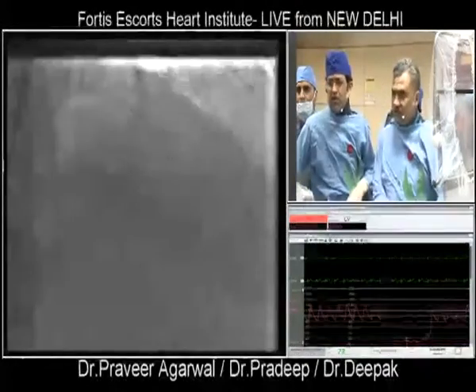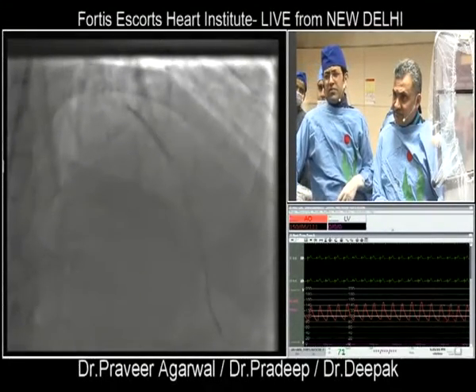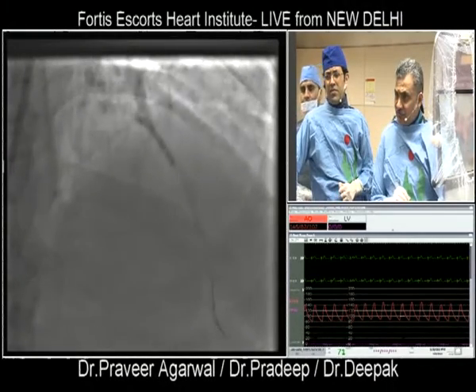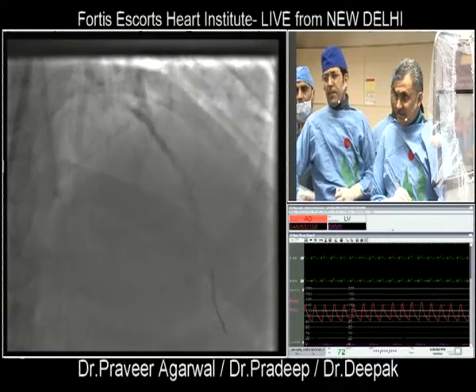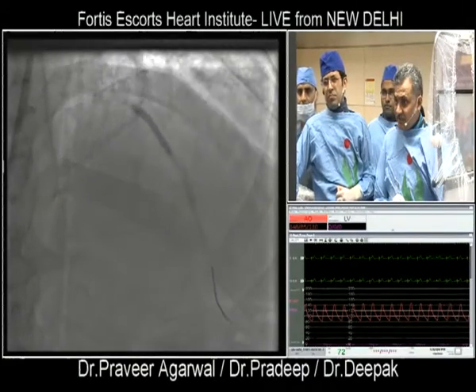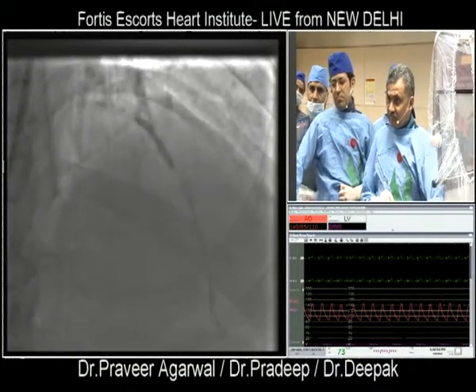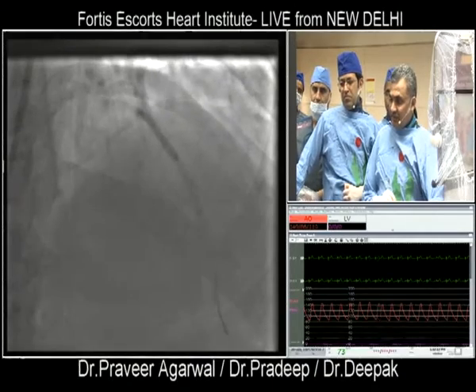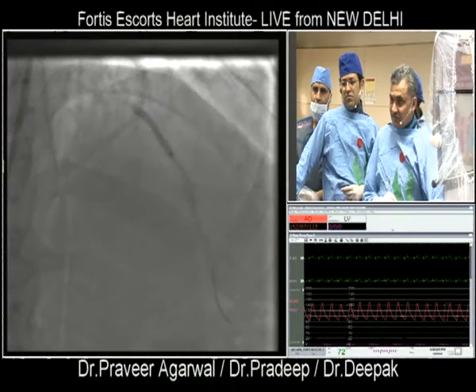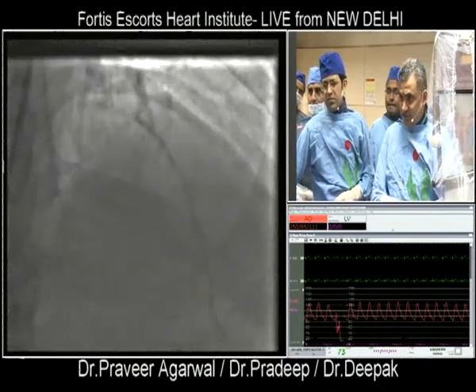1, 2, 3, 4, 5, 6, 6.5, 7, 8, 9, 10, 11, 12, 12.5, 13, 14, 15, 16, 16.5, 17, 17.5, 18. At 18, this becomes nearly about 3.36. Deflate, please. There's no ST elevation, patient doesn't have any angina.